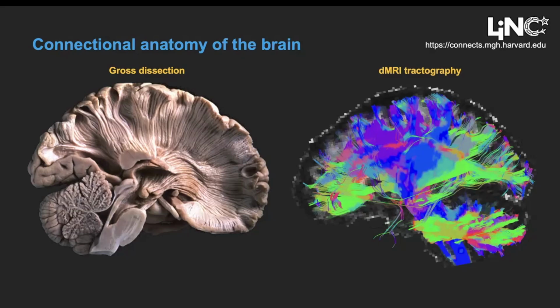It gives us information about the full connectivity of the brain, but of course it has its own limitations. It's known not to have the accuracy of the classical, invasive anatomic techniques. However, it's the only technique that we have to date to be able to image the brain connections in a living patient, which is helpful for several different reasons.